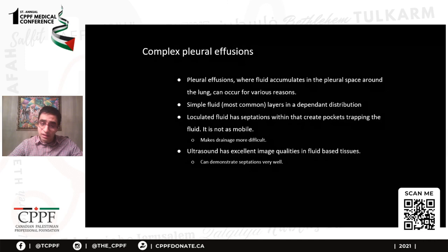CT can also help. It can demonstrate areas of the pleural effusion that are not dependent and not going down through gravity, but ultrasound is probably the cheaper and easier test.